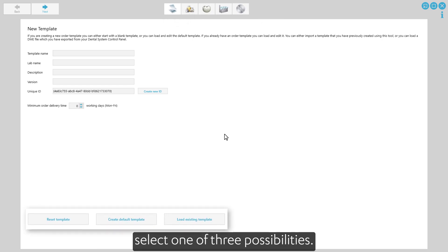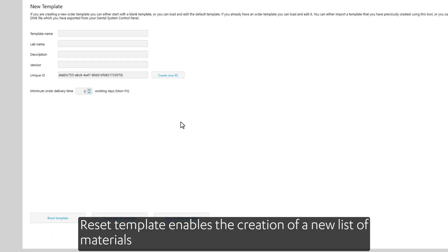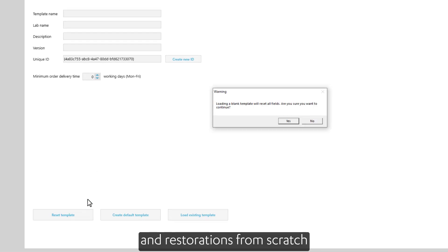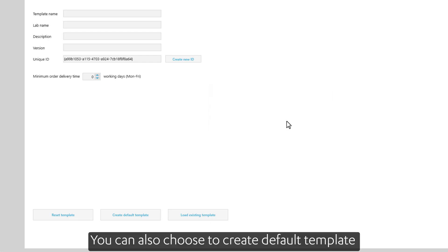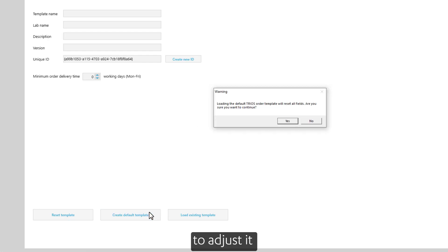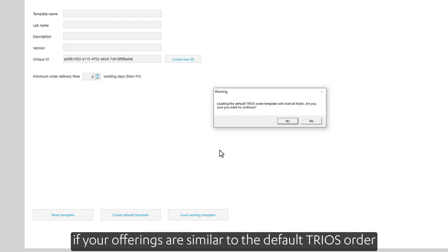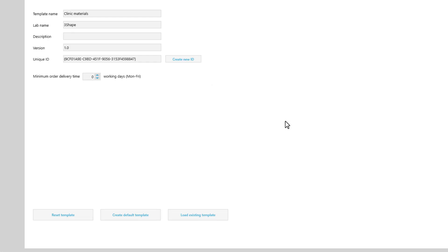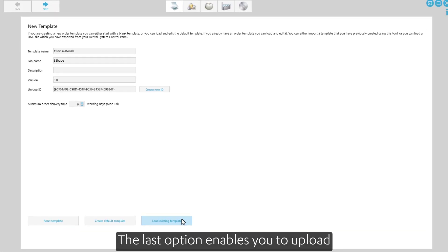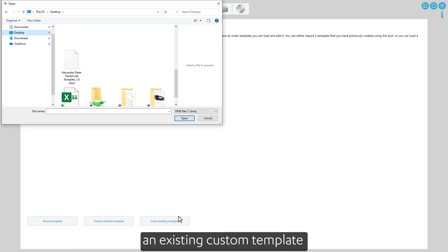At the first step of customization, select one of three possibilities. Reset Template enables the creation of a new list of materials and restorations from scratch. You can also choose to create a default template to adjust it if your offerings are similar to the default TRIOS order form.